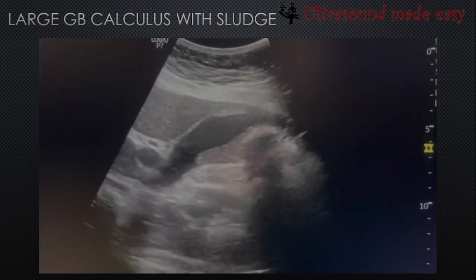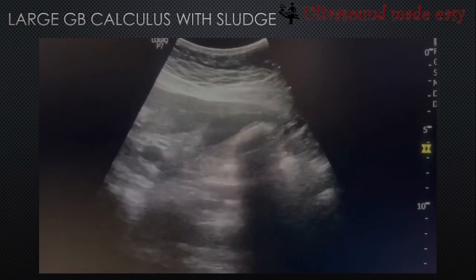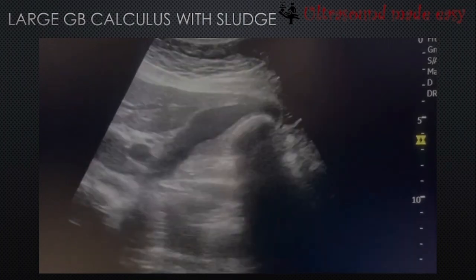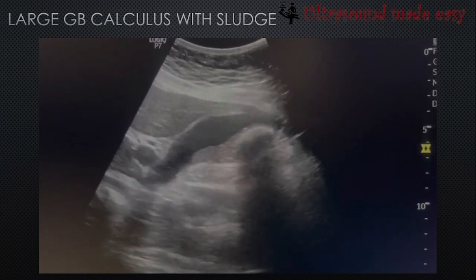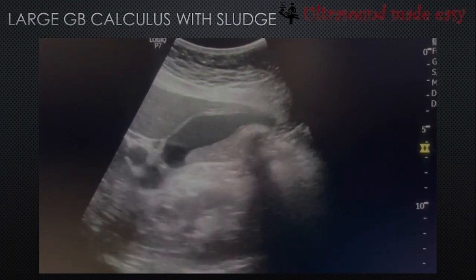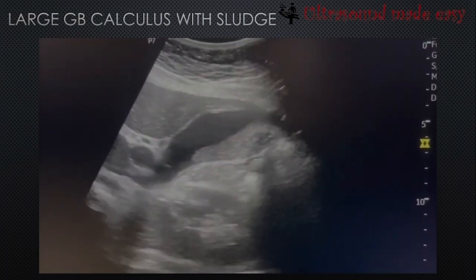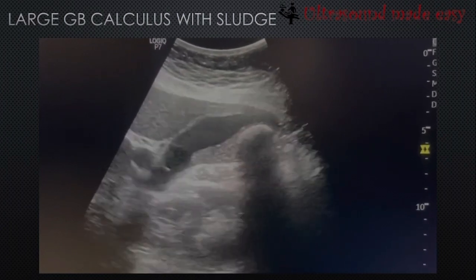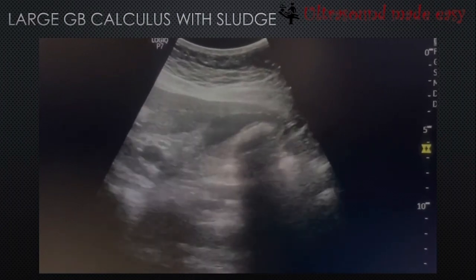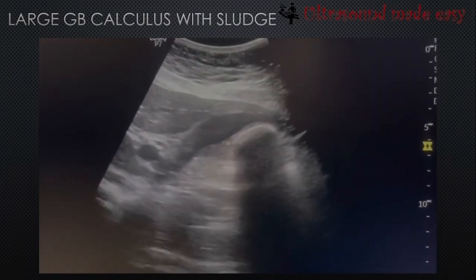This is another case in which there is a large calculus giving posterior acoustic shadowing, along with echogenic content present in the gallbladder. These echogenic contents are nothing but sludge. So sludge with calculus is found in this case: a distended gallbladder with sludge and a single calculus giving posterior acoustic shadowing.